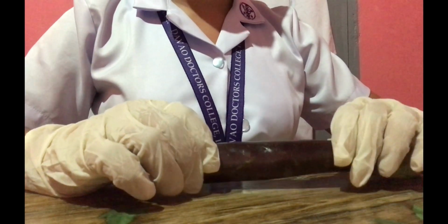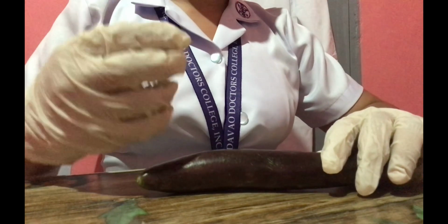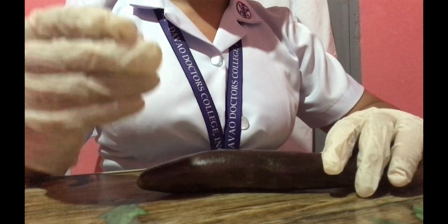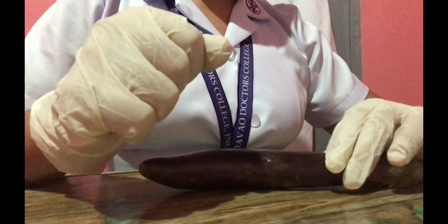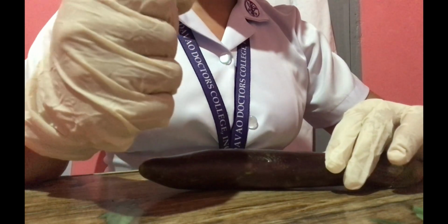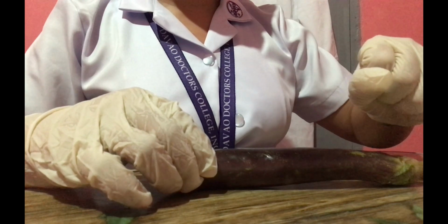As the agency protocol indicates, clean the site with an aseptic swab. Start at the center of the site and clean it, widening the circle to about 5 centimeters or 2 inches. Then allow the area to dry. Then after doing that, we clean the selected site using an aseptic swab, which I've already done, and place the swab between the third and fourth fingers of the non-dominant hand, or position the swab on the client's skin above the intended site.